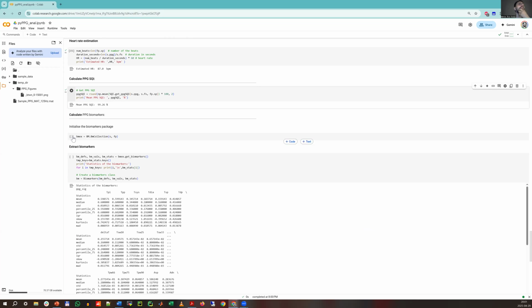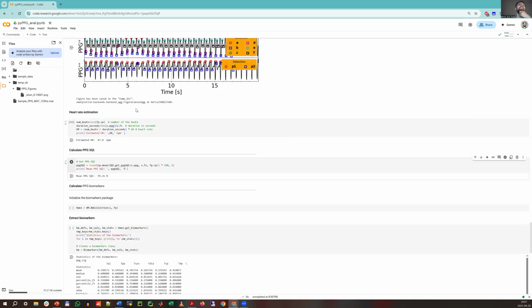So we make a signal quality assessment. As you can see, the signal quality of this PPG signal is very good.